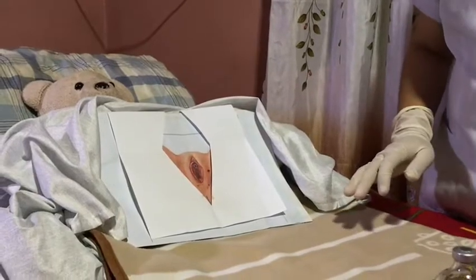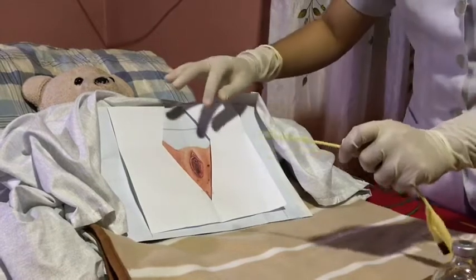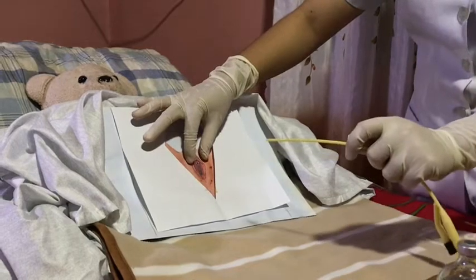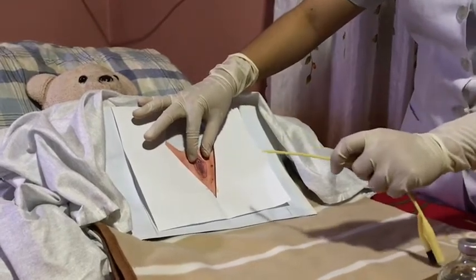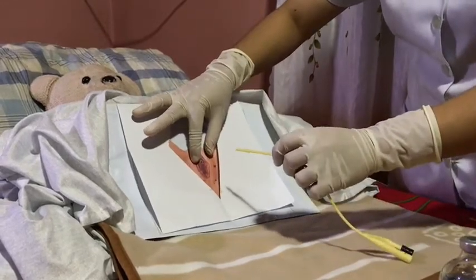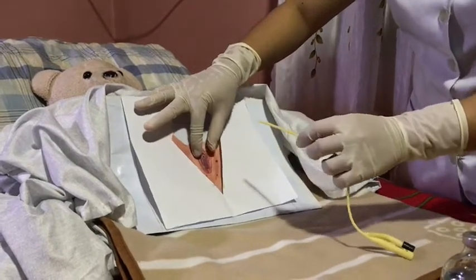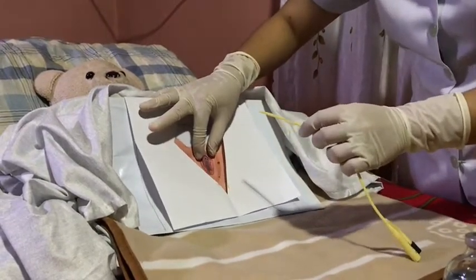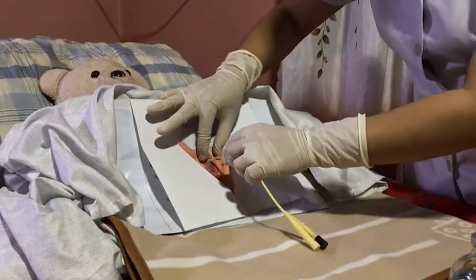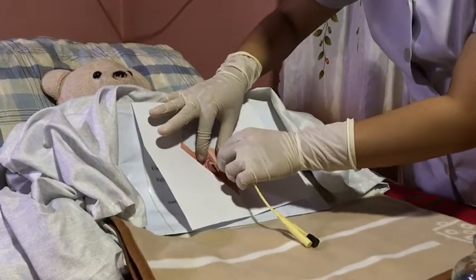Now pick up the catheter at least 3 inches from the tip and place the thumb and one finger of the left or right hand between the labia minora and separate and pull up gently. Now insert the catheter into the meatus for 2 to 3 inches or until the urine begins to flow. Okay, ma'am, I'll be inserting the catheter. Just relax, ma'am. Alright, it will be a little bit itchy.